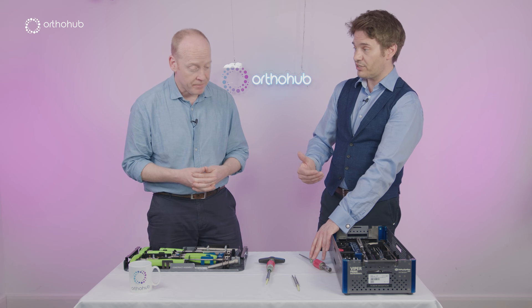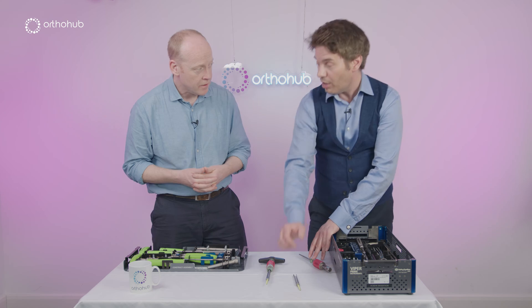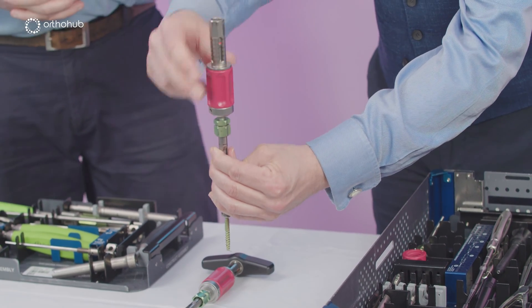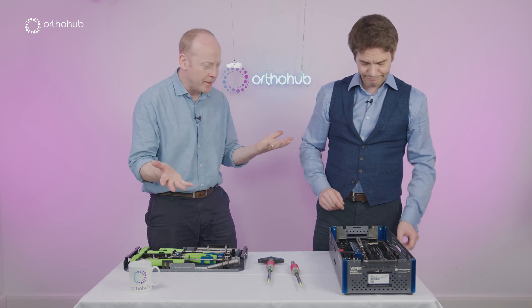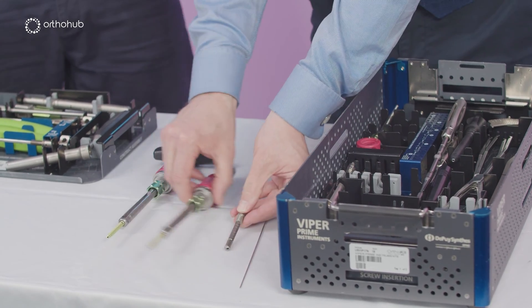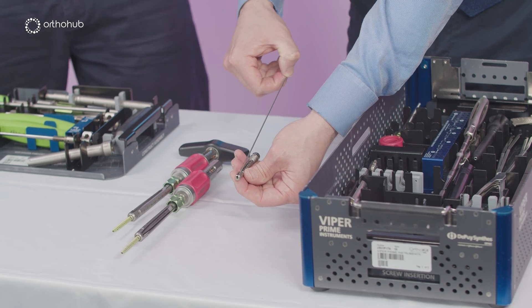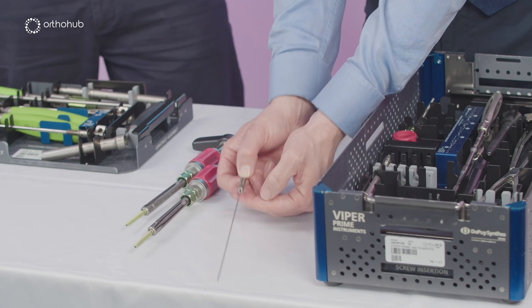There are also fenestrations — four in total, two visible here — so you can inject cement and increase strength further. Right at the tip, the thing that allows this screw to do everything in fewer steps: it's effectively sharp, self-cutting, self-tapping — it doesn't need a pathway creating for it. We apply the screwdriver to the screw; the screw size is decided preoperatively based on imaging, then this just screws down. The stilette holder has a series of numbers that correlate to the screw — so for a 45 screw, pretty much always a 45, that just drops into the slot and rotates to lock in place.